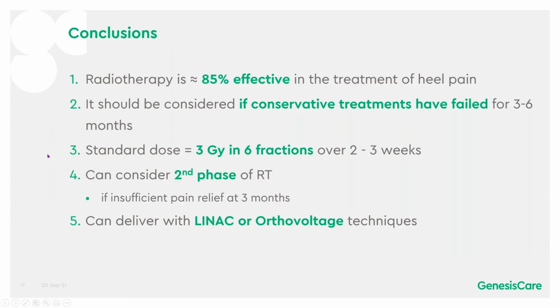So in conclusion, radiotherapy is 85% effective in the treatment of heel pain. It should be considered if conservative treatments have failed for at least 3 to 6 months. The standard dose is 3 gray and 6 fractions over 2 to 3 weeks. And you can consider a second phase of radiotherapy if there's insufficient pain relief at 3 months. And it can be delivered either with a LINAC or orthovoltage techniques.